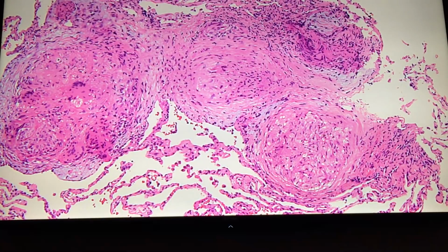It's naked granulomas. It is naked in this case, but that doesn't necessarily help. There can be lymphocytes around it, and that doesn't really change the differential. Anything else? What else helps? Is it peripheral or central? Not really. I think the other thing that helps is how the lung looks away from the granulomas.